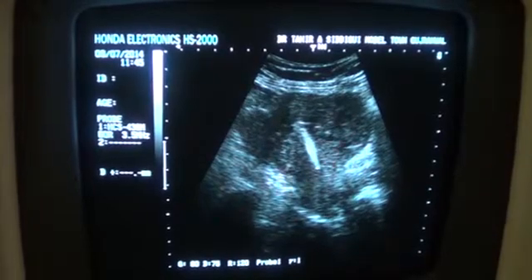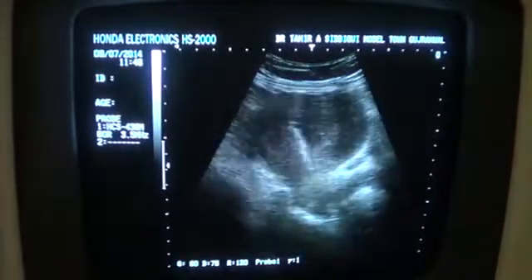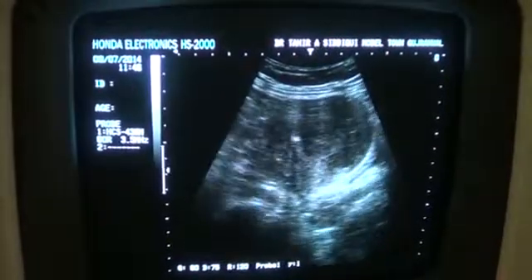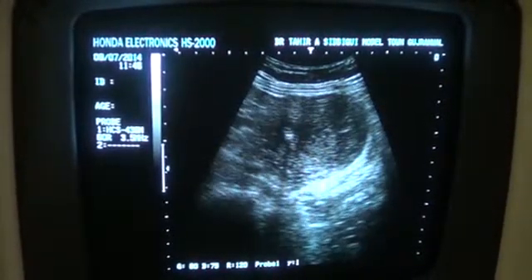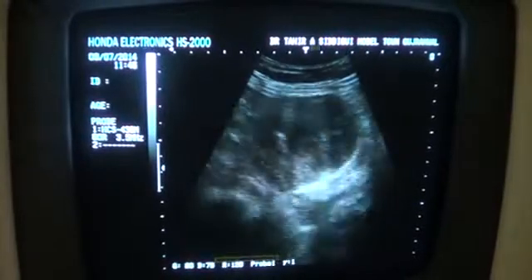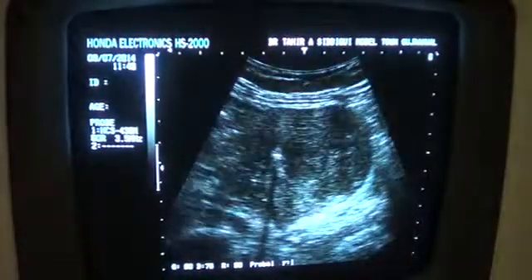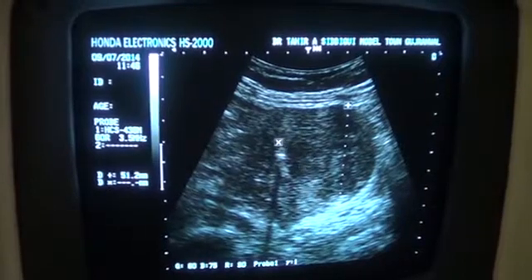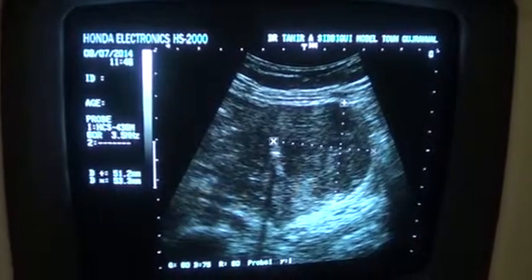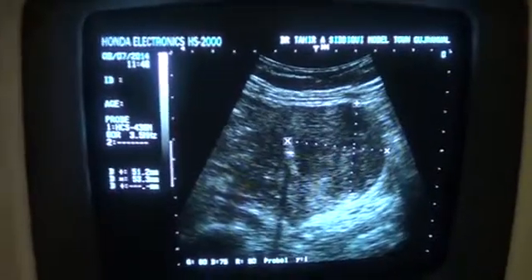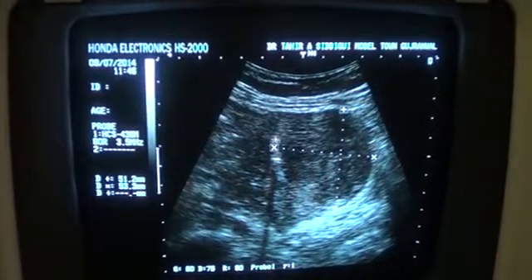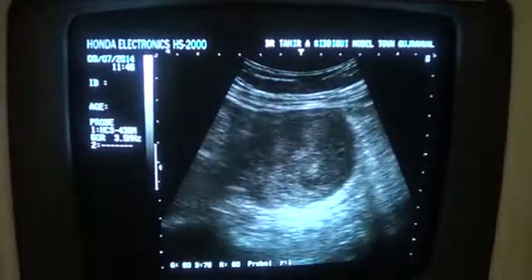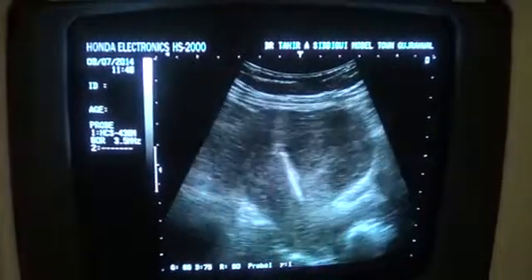This is the fundus, the posterior myometrium. As I move the probe and angle it slightly towards the left side, I see a solid, relatively hypoechoic mass — which is in fact a myoma — relating to the anterior wall of the uterus, with internal calcification giving marginal calcification and posterior shadow. It measures approximately five by five centimeters.